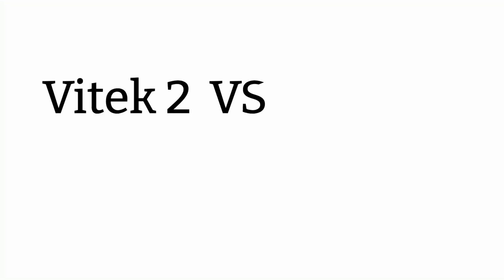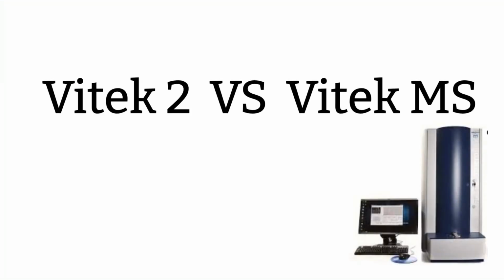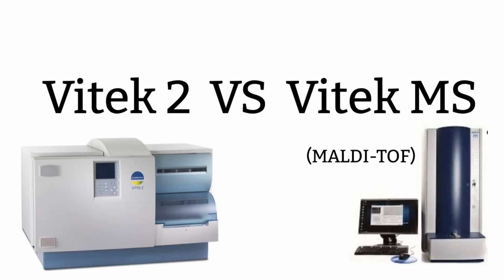I will talk about the two instruments that my hospital uses, which are Vitek 2 and Vitek MS, also known as MALDI-TOF. Let's start with Vitek 2.